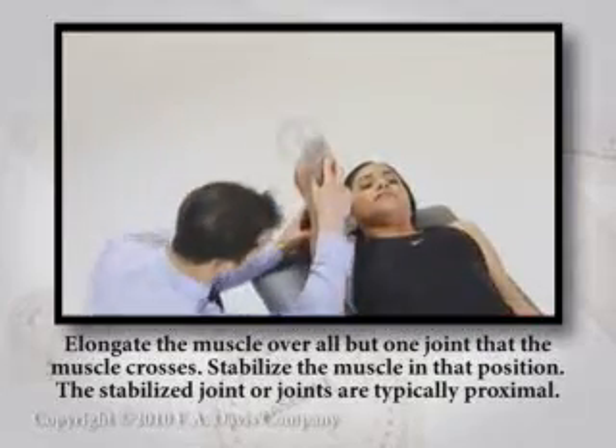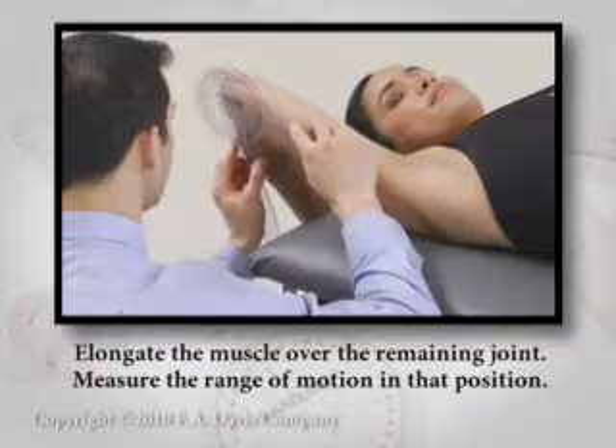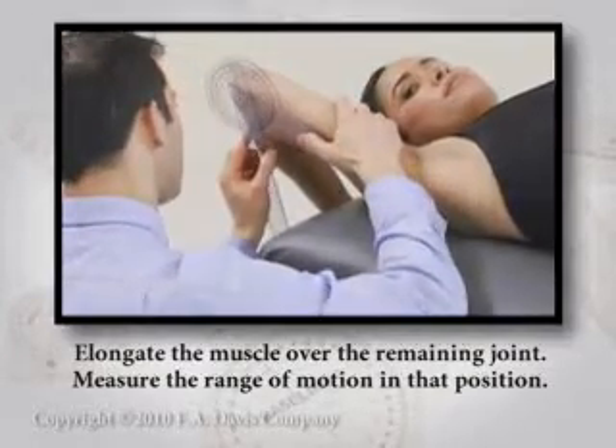The stabilized joint or joints are typically proximal. Elongate the muscle over the remaining joint. Measure the range of motion at that position.